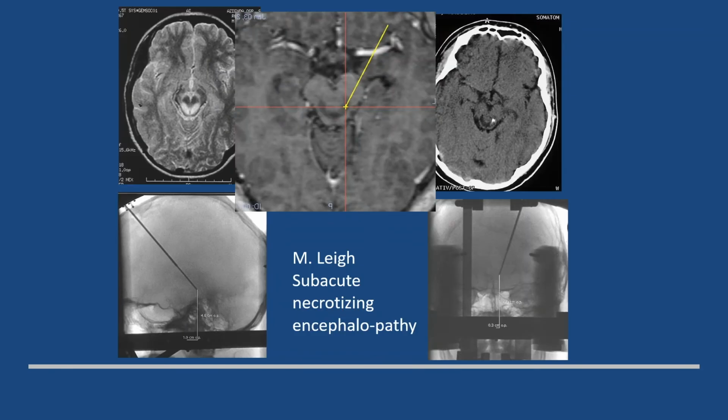So that's about resection. I think it's very intuitive and straightforward. Of course, an intraop MRI would be even better, but this is a very good solution. You can always fuse it back to the MRI scan.